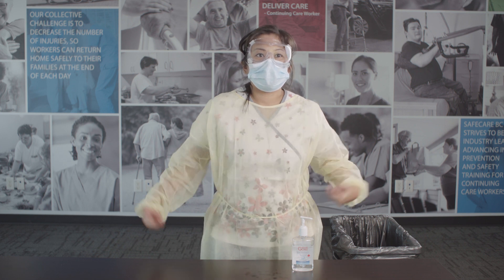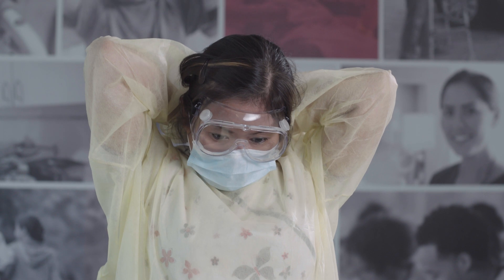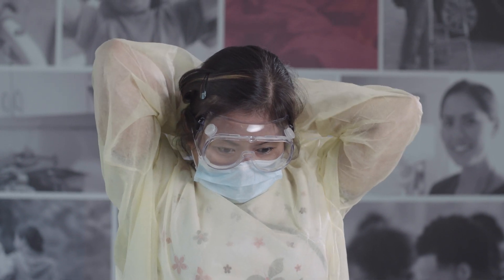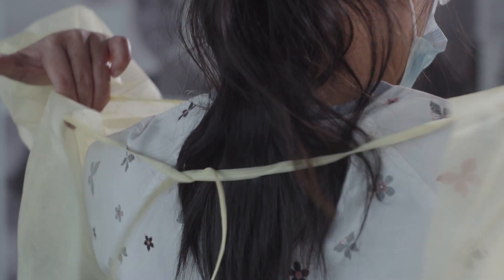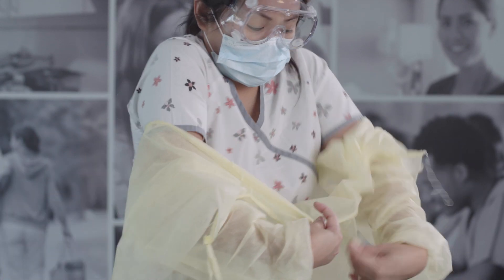Next, remove your gown. Unfasten all ties or closures. Avoiding any forceful movements, reach up to your shoulders and pull the gown off and inside out. Avoid touching the outside surface.